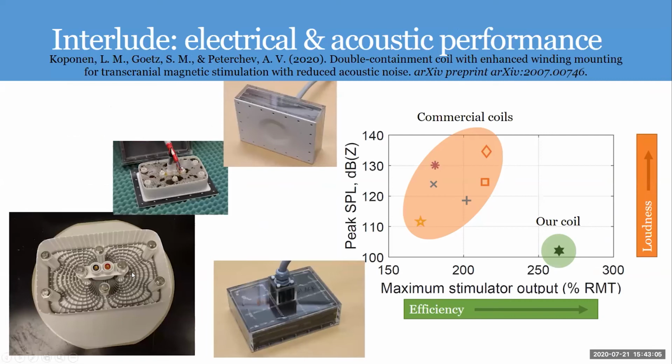So the wires here are roughly 10 gauge AWG wire, but it's not just 10 gauge AWG wire. It is compressed Litz wire. So it consists of 70 individual 0.2 millimeter strands that each have a glass polymer coating on them. And on top of them, here we have 0.39 millimeters of FEP, because this coil will actually see up to 10 kilovolts between those two terminals. And to make it rigid, the potting material there is basically corundum filled epoxy. So it's one of the ceramic particles, similar to industrial sapphires.